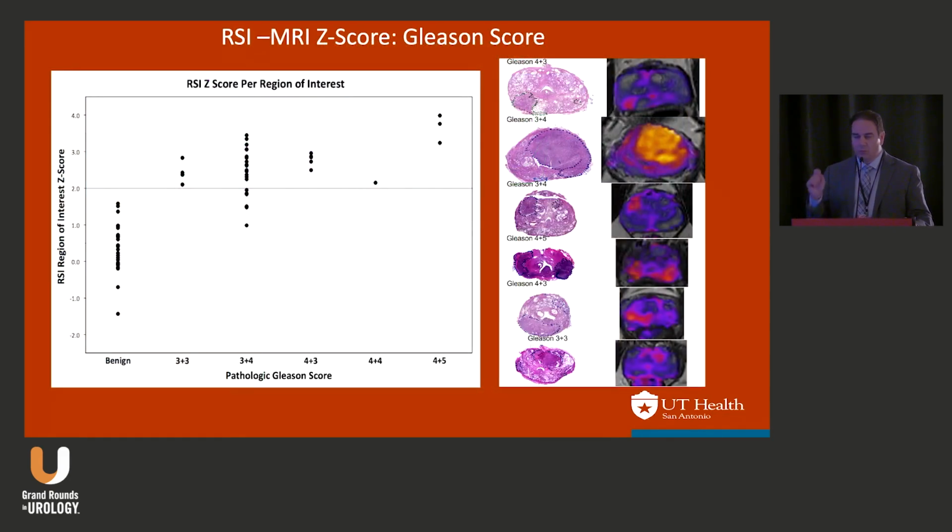What I really wanted to do, I call it a Hounsfield unit for prostate cancer. How do we make this a real imaging biomarker? How can we take the region of interest, circle it, and give us a number? We do it with ADC, but it's not a great number, and we don't necessarily use it clinically. So we've created these maps, and now I can take those specific numbers and put them into a score, and we can see that it increases by Gleason score. So can we get to a point where we can use this clinically?